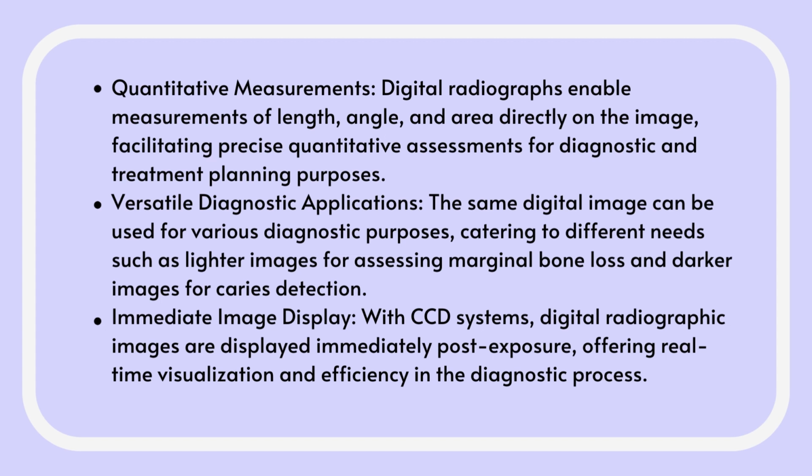Immediate image display. With CCD systems, digital radiograph images are displayed immediately post exposure, offering real time visualization and efficiency in the diagnostic process.